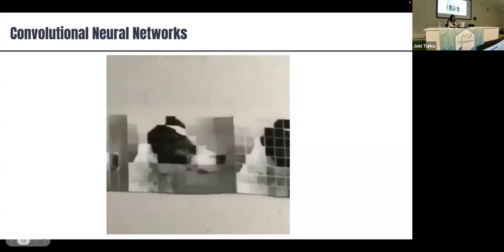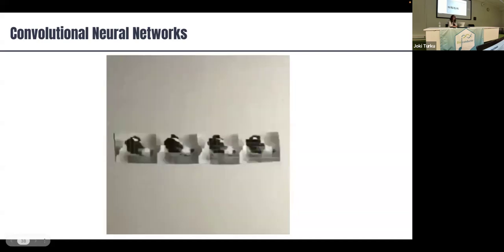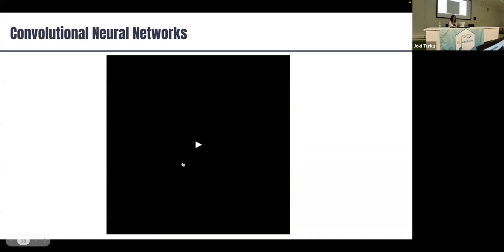So actually we don't need all the pixels in the images. We just need part of them to understand that it's a dog. And it's more or less the same with biological images, maybe to understand that it's a tumor or a stromal region or something else.